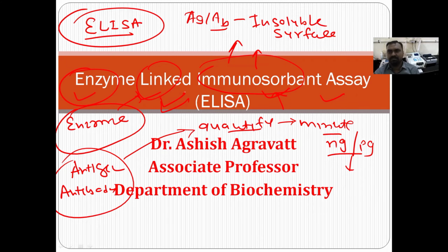Nowadays we have better technology, chemiluminescence, for hormones and tumor markers which are in nanograms and picograms. But this is a basic technique, and understanding it will also help you understand chemiluminescence. I will make a separate video about chemiluminescence also.